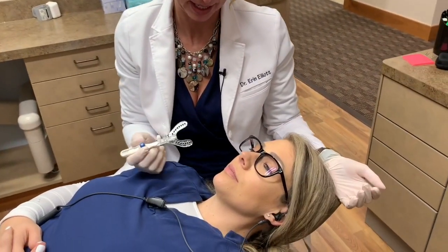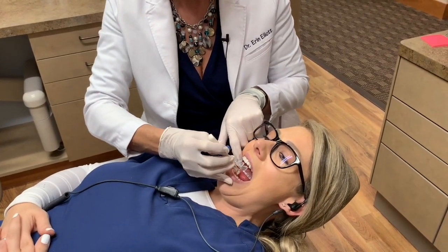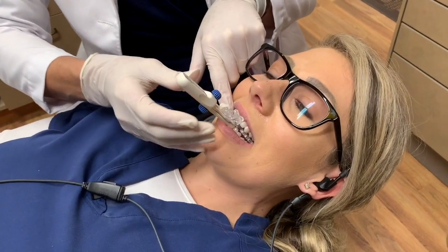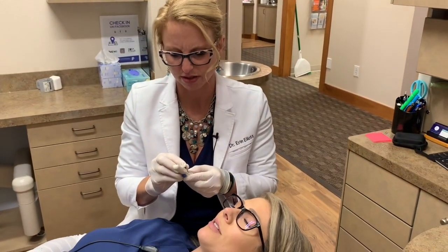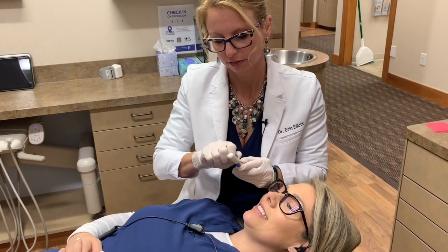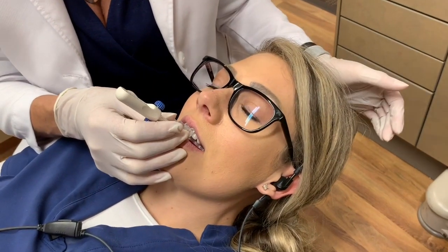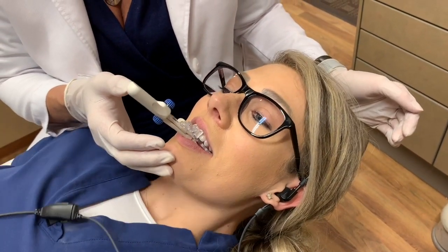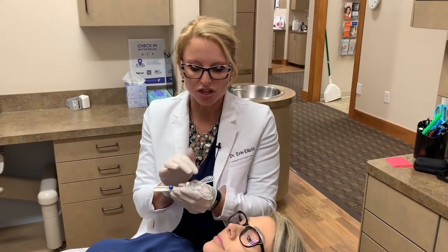Now we come back to the mouth. Can you go ahead and make that snore noise for me again? I place the fork in — scoop it in, line it up with the midline, and go ahead and bite down. Now go ahead and give me that snore noise again. Are you getting better breaths? That would be a great starting position. You can go back or forwards and have the patient snore to see where you get the best breaths.